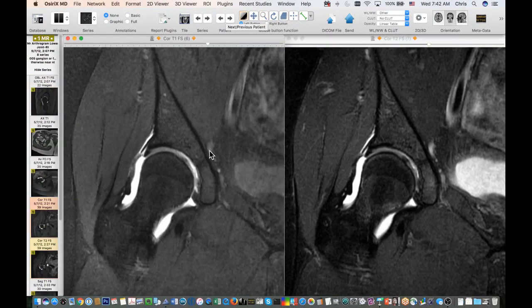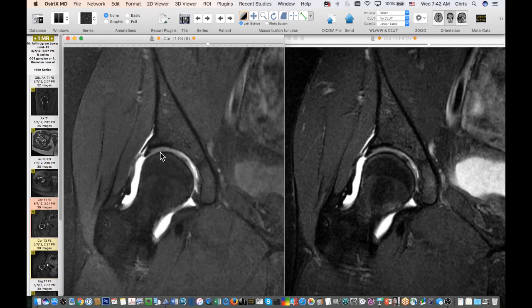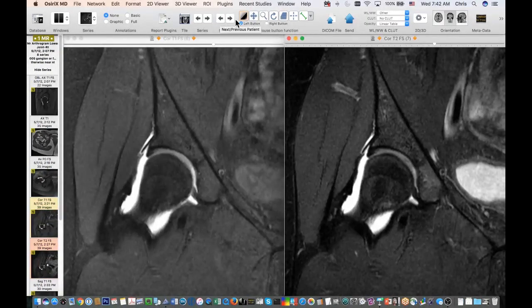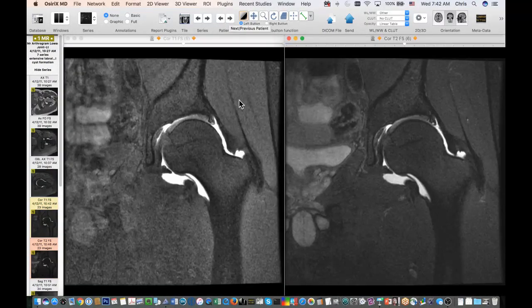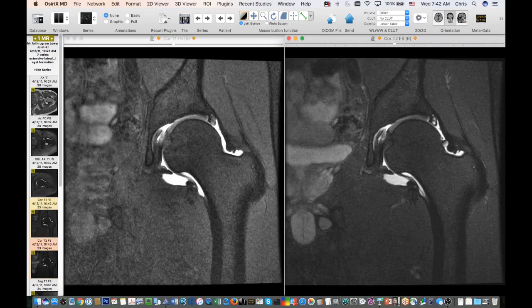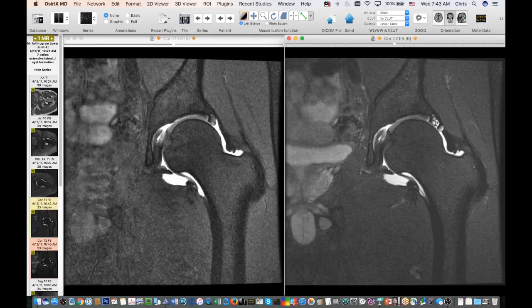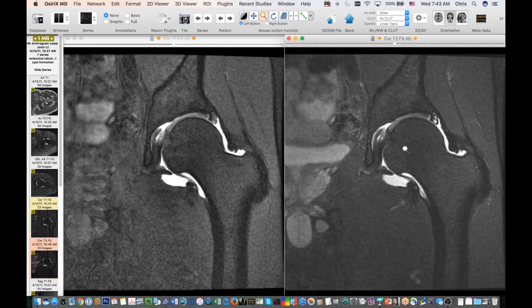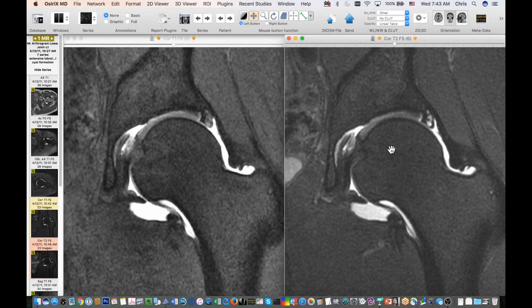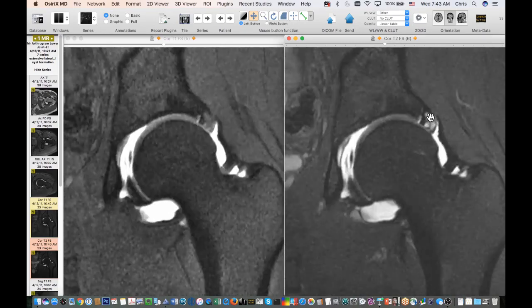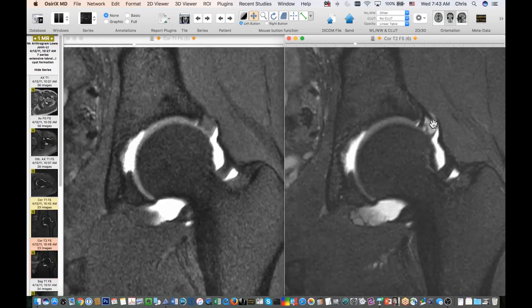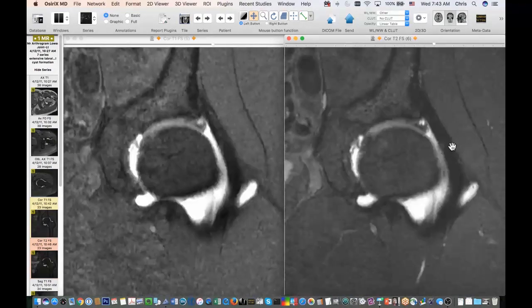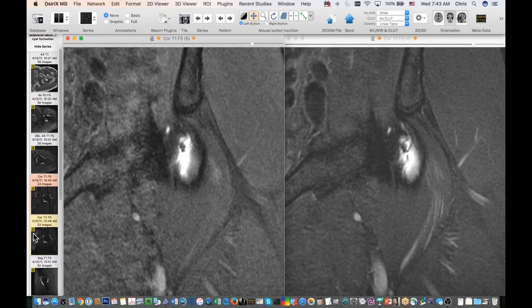We also do MR arthrography in many patients. Here's a coronal T1-weighted fat-suppressed image showing the acetabular labrum, and a T2 fat-suppressed image showing the labrum. Here's an example of an abnormal labrum in a different patient. On the coronal T1 fat-sat and T2 fat-suppressed images you can see increased signal within the labrum along the superior part, and scrolling along it goes pretty extensively throughout the posterior labrum and then anteriorly as well.